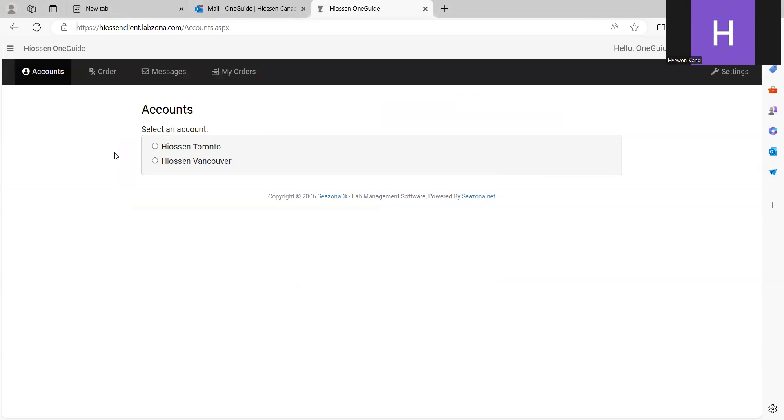If you have multiple clinics, you will see this screen. Otherwise, it will direct you to the order menu. Since I have multiple clinics, I am directed to this page.